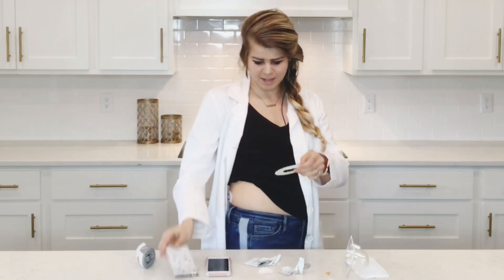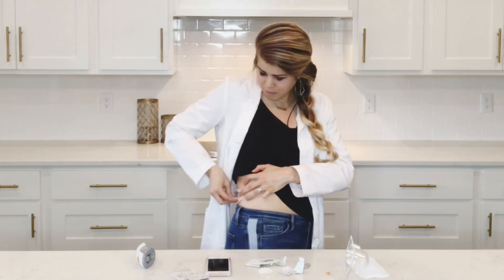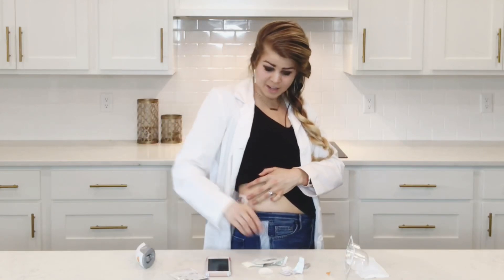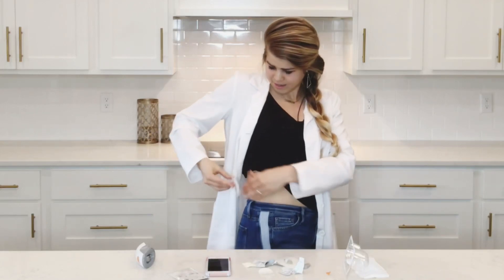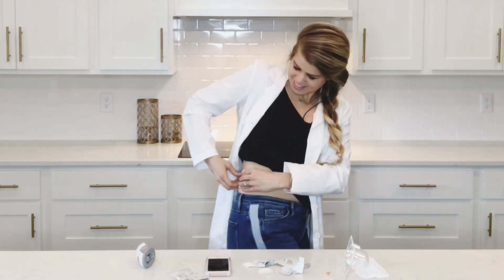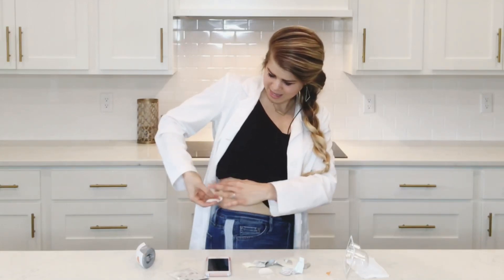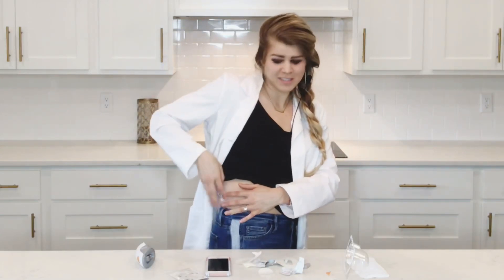I'm going to get an overpatch ready. Now that the sensor is on, I'm going to take my Skintac and wipe around — so this is like double duty. We put it on the adhesive but not directly on the skin, and now we're going circling around the sensor part on top of the adhesive. Then I take the overpatch, concentrate, and stick it on on top of where I put the Skintac. Now it is really stuck on there. Take the paper off and smooth it with your fingers.